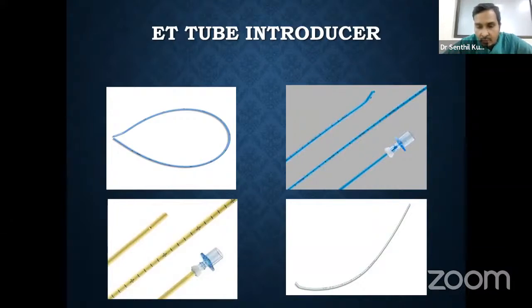So what you are supposed to do is introduce the laryngoscope, then introduce the bougie. Sometimes you can railroad the endotracheal tube already loaded, or you can introduce the bougie first. This is very useful in situations like Cormack-Lehane grade 3, where you are able to see only the tip of the epiglottis, or in Cormack-Lehane grade 4, where you are not able to see any epiglottis at all. So what you are going to do is, very close to the laryngoscope blade, advance the bougie. Because of the anterior direction, it might go anteriorly. So you can't do much manipulation, but once it goes anteriorly, it can enter.